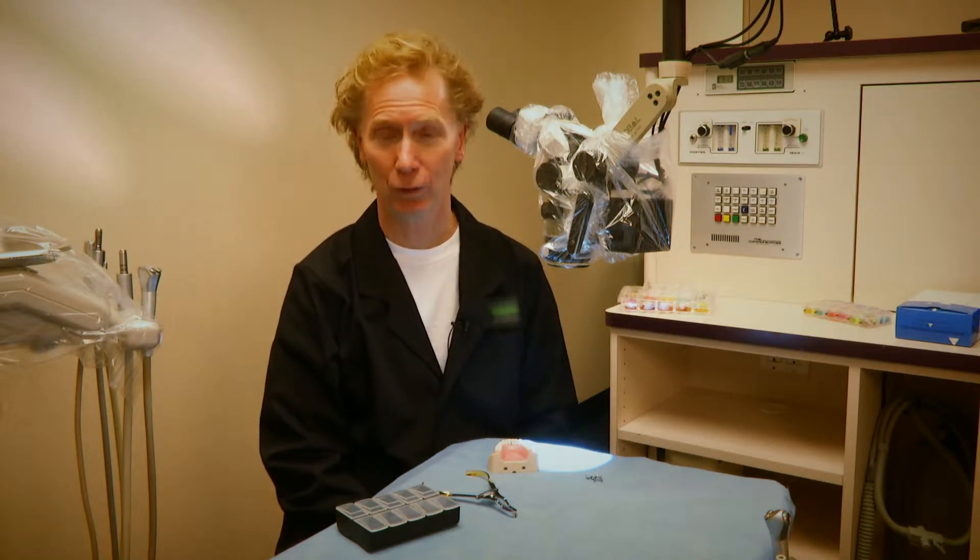Hi, I'm Dr. David Clark. We're talking today about the new dual-force matrix system that's been developed between a collaborative effort with me and Clinician's Choice.